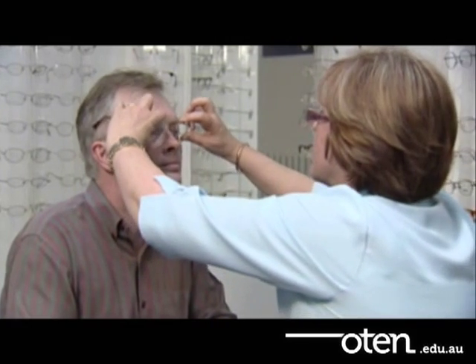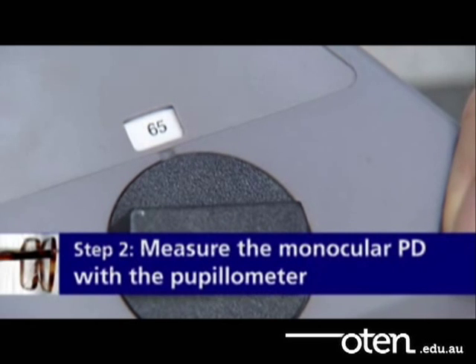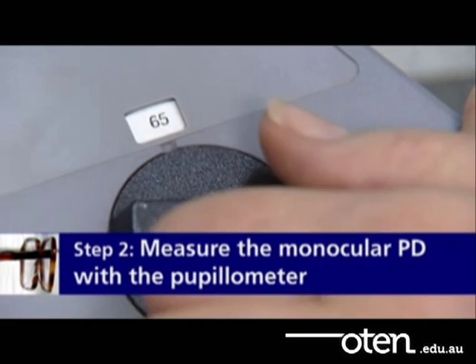The corneal reflex pupillometer is the only instrument designed to measure the distance between the visual axes and not just the distance between the pupil centres. Before you take the distance PD, set the working distance knob to infinity.